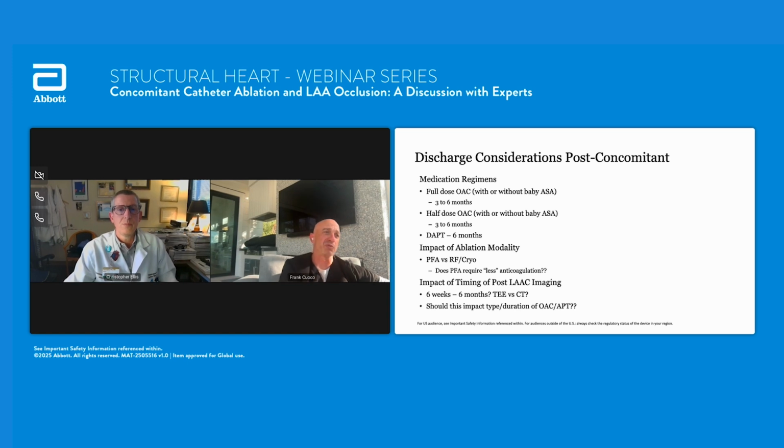I think in the past with radiofrequency and cryo, where there was more injury to the endothelium, more risk for thrombus, a lot of us feel that maybe the risk is much, much lower with PFA, pulse field. And so maybe we don't need that full dose anticoagulation. And you brought up the topic earlier, Chris, about using dual antiplatelet therapy after the device. Is that going to be safe? My gut is that it will be with pulse field. Obviously, we haven't proved it yet.